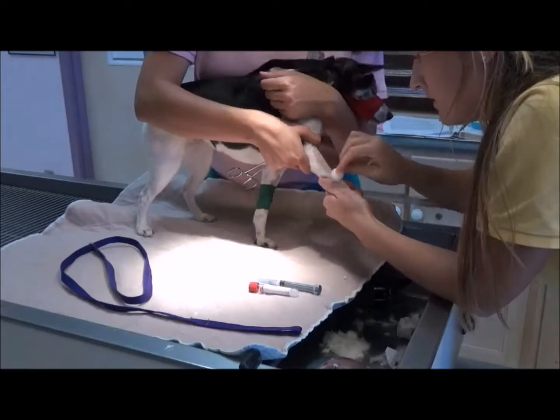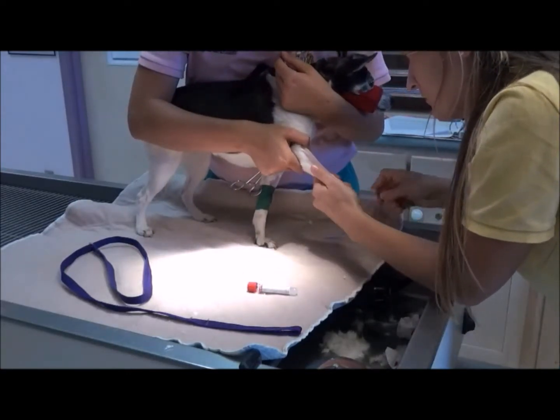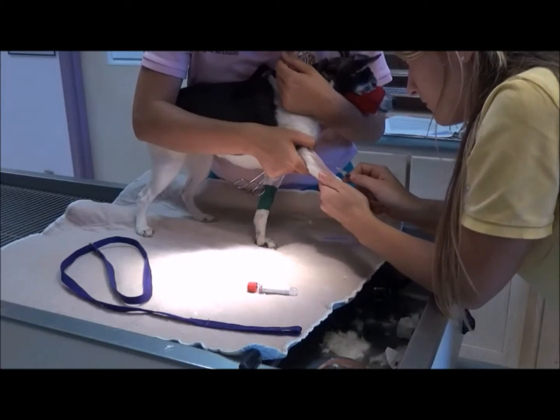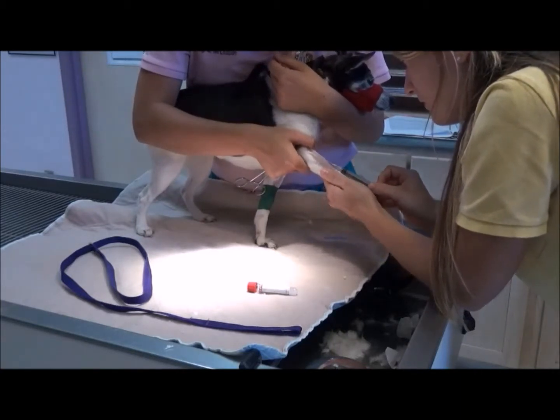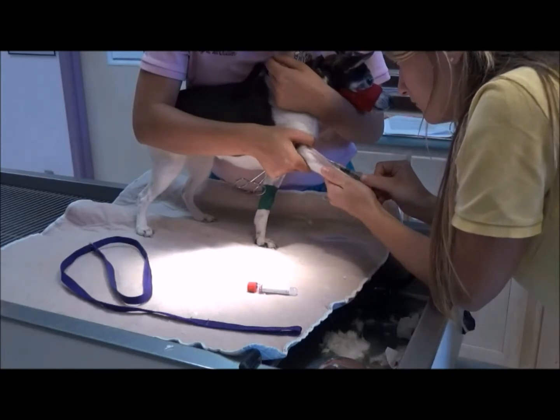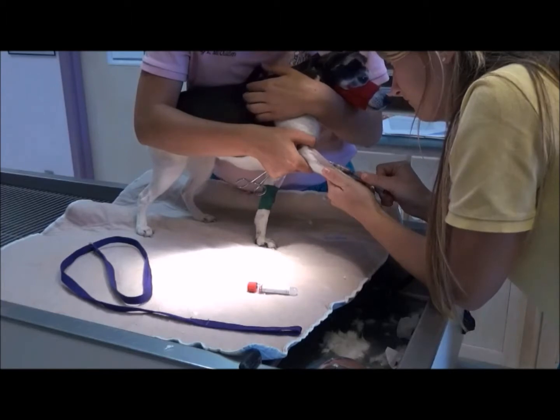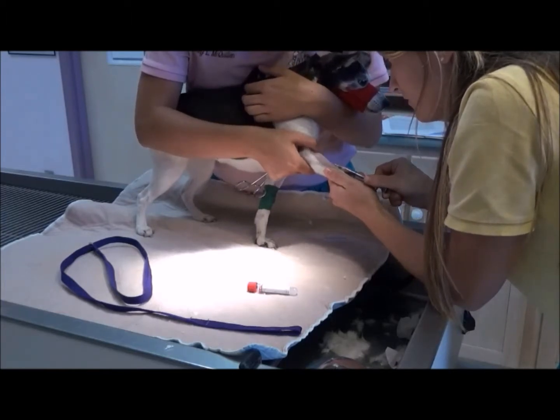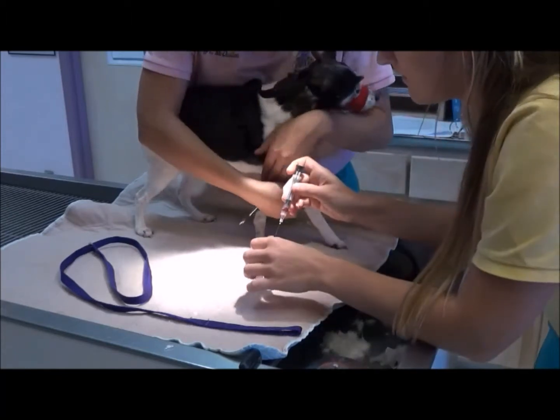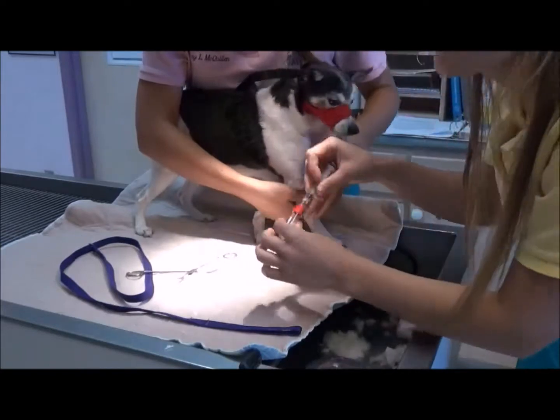Just cleanse the area with the alcohol swab. Looks like 20, so I'll have you ready to hold off on that. Oh, perfect. And that's perfect.